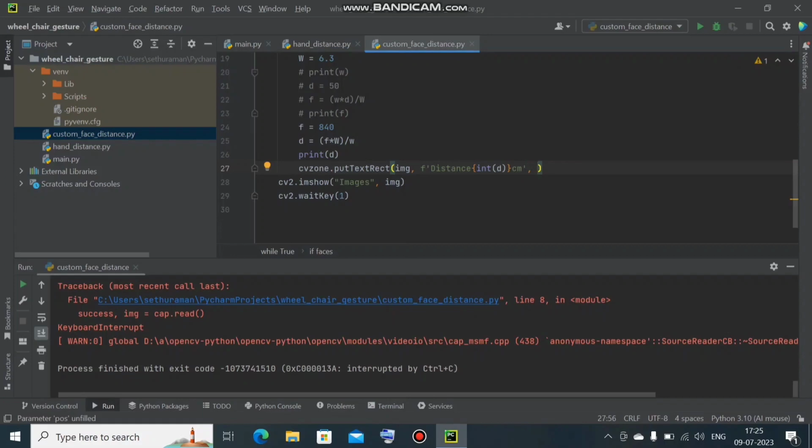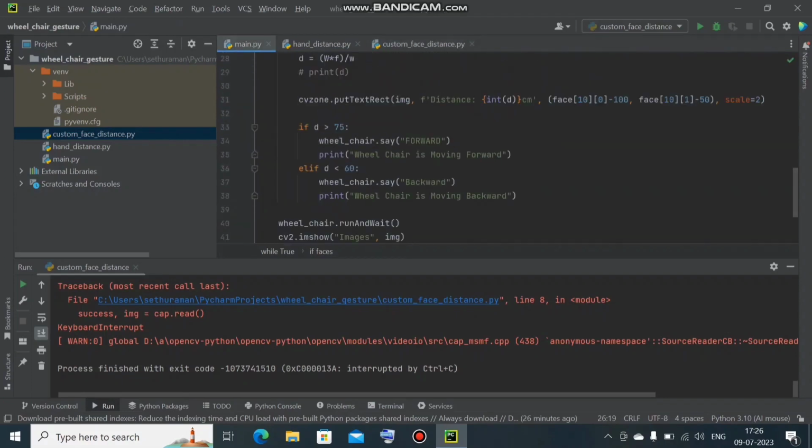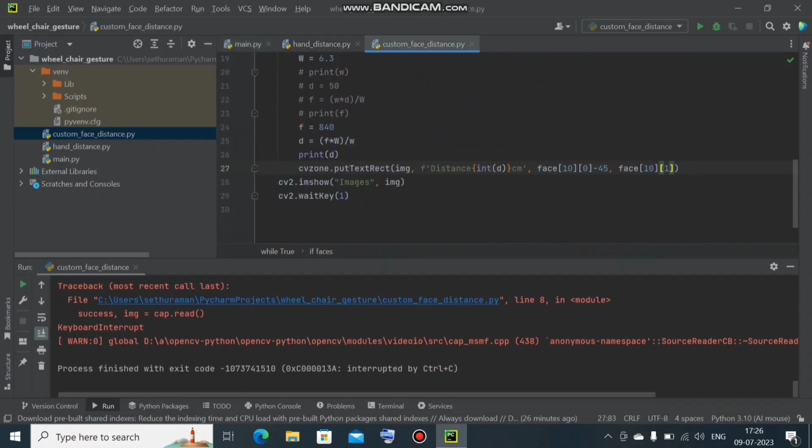So now, at which position does the result need to be displayed? At the position of face of 0th element minus 45, comma, face of the first element, not the 0th element this time, with the first element. I forget what to put next, minus 1, so 150. Okay. So here 100 is the position, and here 50. We will keep the scale value as 2.